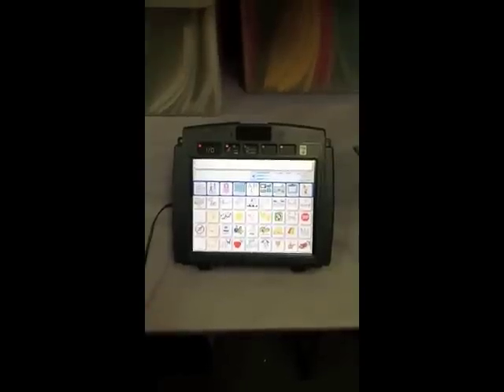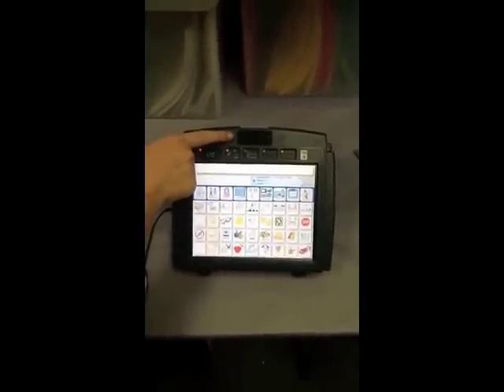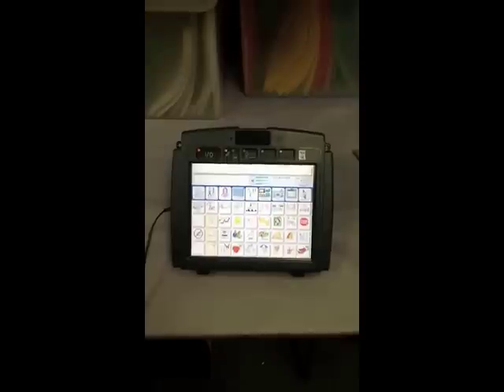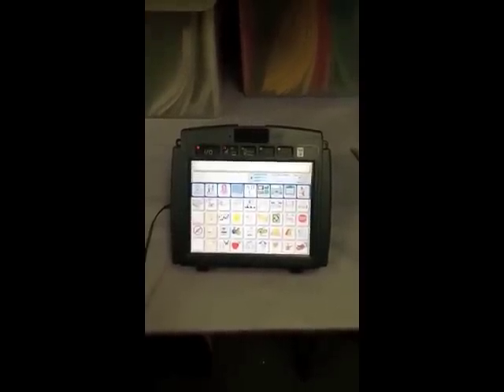This Vantage Lite system has an infrared sensor on the front of the device. Others do not, and if this is the case, you may have to use an external device plugged in on the right side of the case.